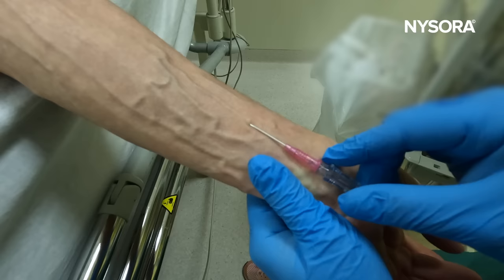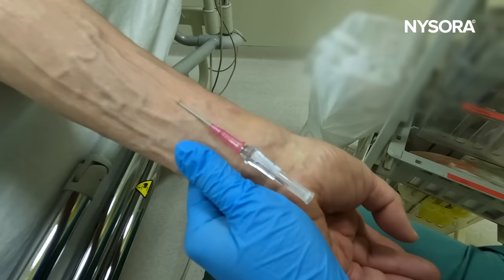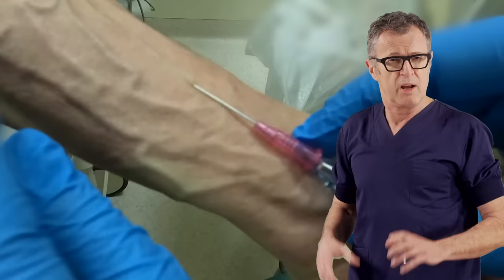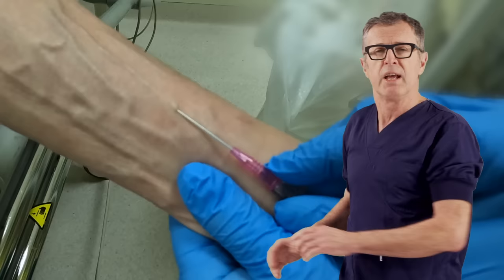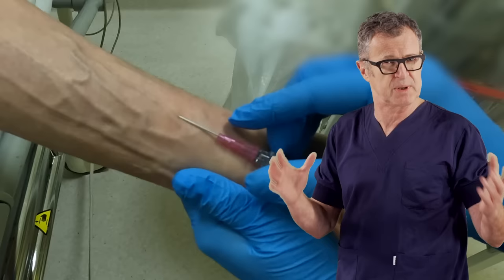Lift the tip up. It's difficult to lift the tip unless you pre-bend. The practitioner tries to pull the needle back, but because the vein is very superficial, the only way to do this properly is to take the needle completely out and reinsert, perhaps at the same entry point. If you do not take the needle out completely, the needle tip will continue to be placed underneath or beside the vein, making consecutive attempts sentenced to failure from the get go.